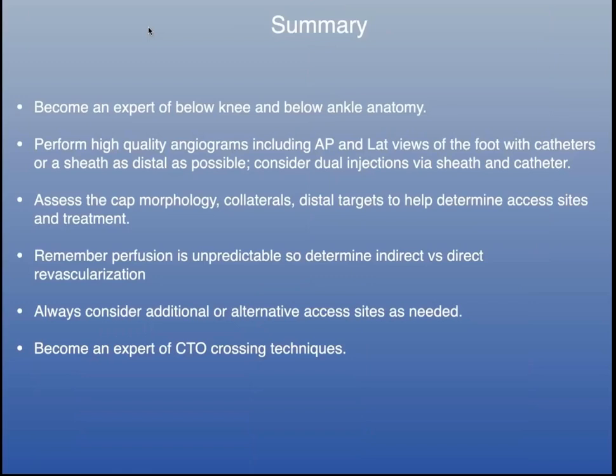So in summary, try to become an expert at below knee and below ankle anatomy. You really have to know the anatomy to the next level of what you thought you knew. You want to perform high quality angiograms, and I think AP views of the foot plus the typical lateral foot that most of us are used to, and try to keep your sheath or catheters as distal as possible.